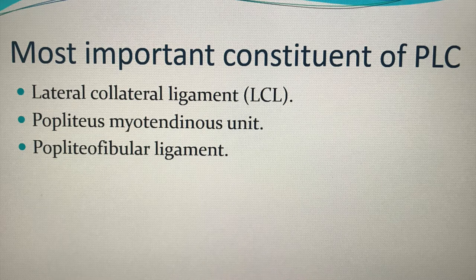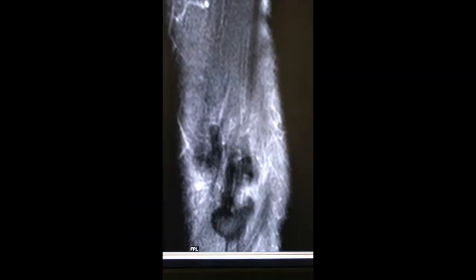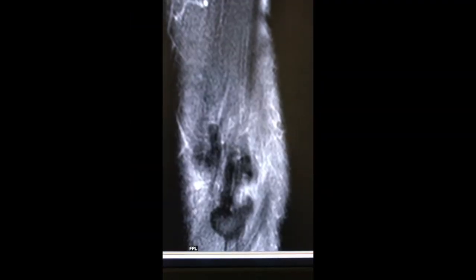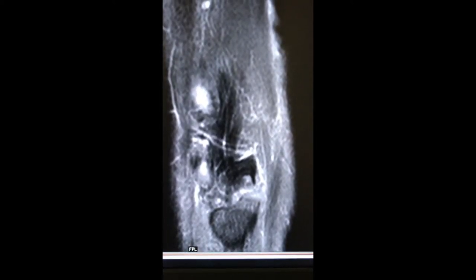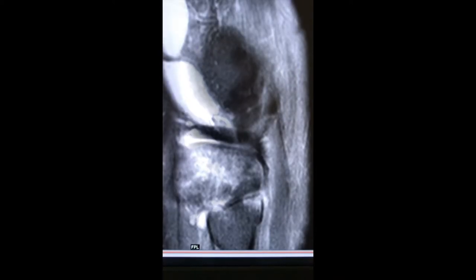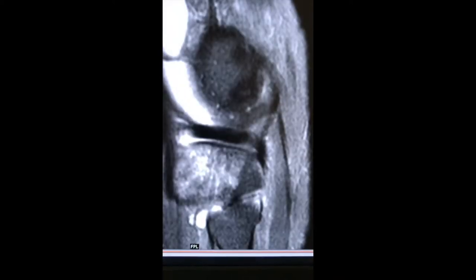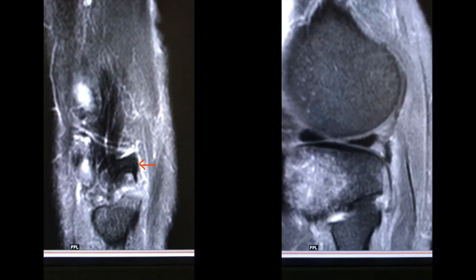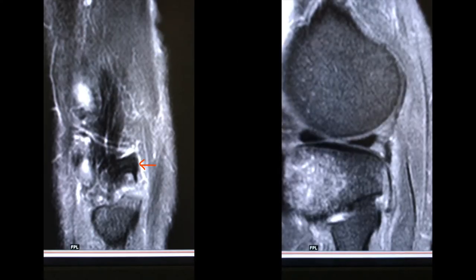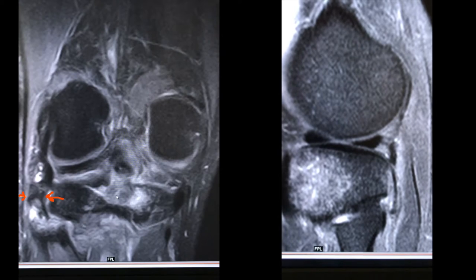Now it is time to see some cases. First we will review a sagittal fat-saturated PD image of the knee. From the extreme lateral aspect, first you get to see the partial tear of the lateral collateral ligament. Then you can appreciate the avulsion of the fibular head, which is due to the avulsion of the biceps femoris tendon.